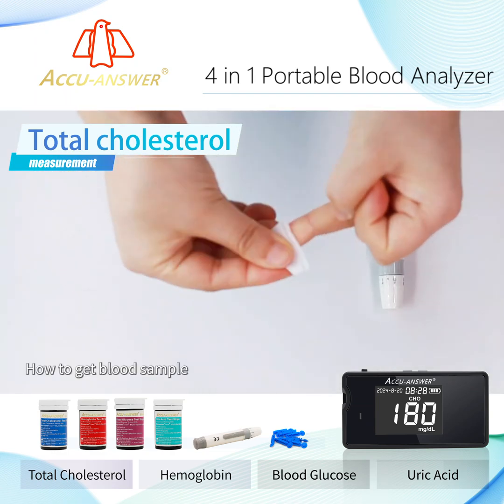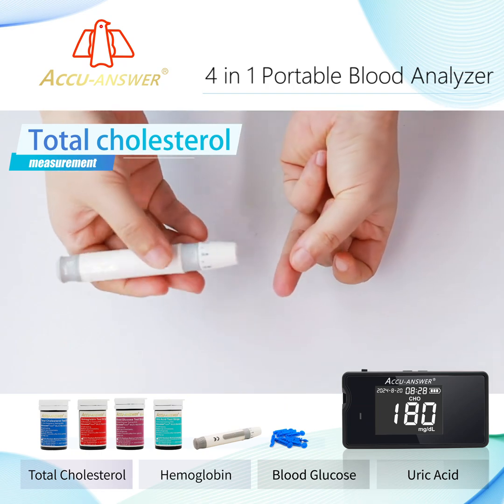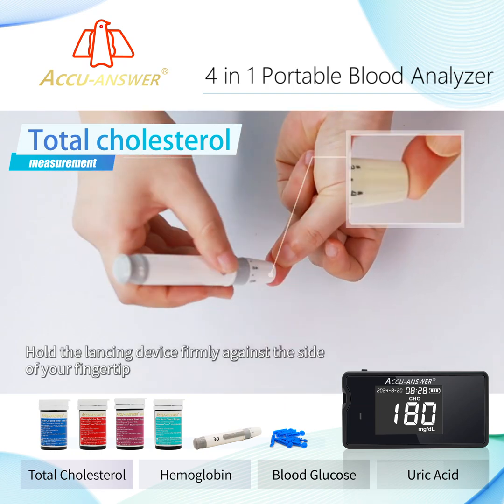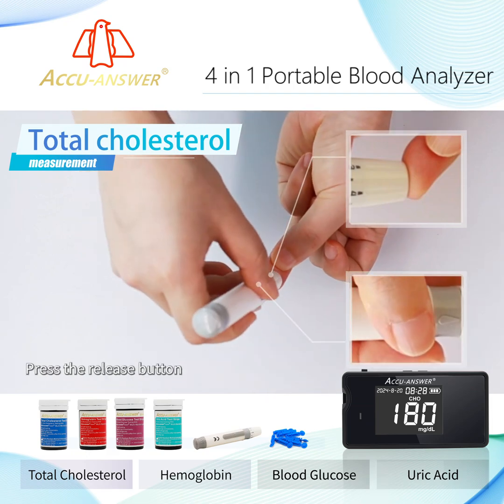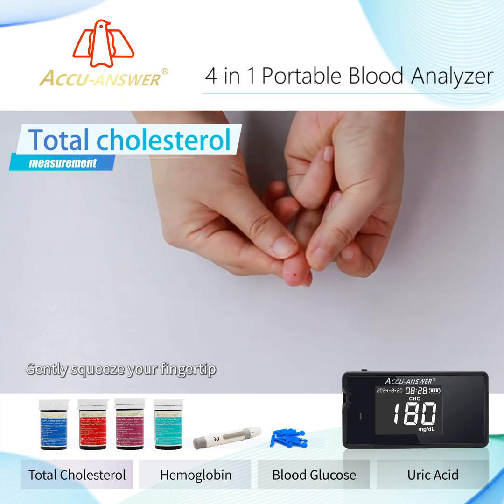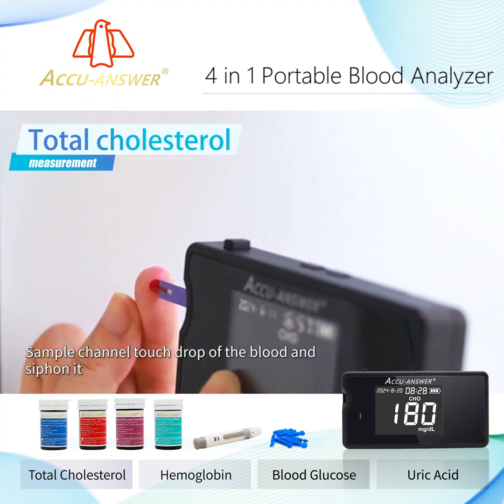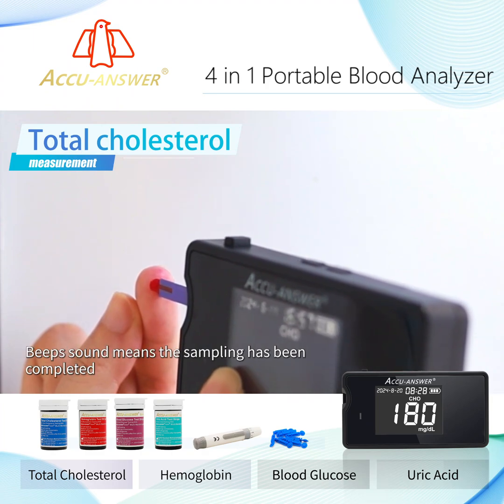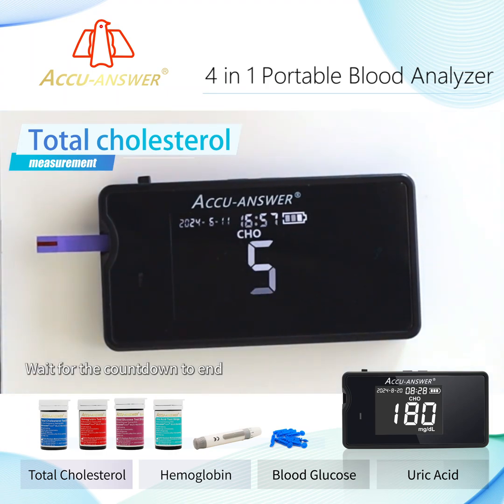How to get a blood sample: Keep fingertips dry. Hold the lancing device firmly against the side of your fingertip and press the release button. Gently squeeze your fingertip to apply the sample. The sample channel will touch the drop of blood and siphon it in. A beep sound means sampling is complete. Wait for the countdown to end and the meter will display the results.